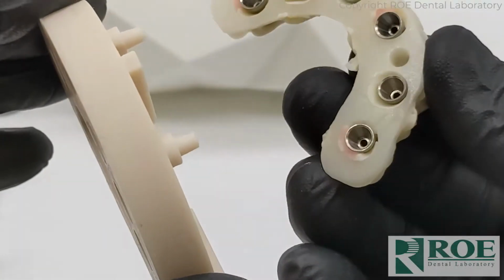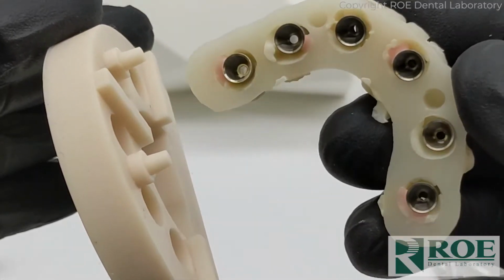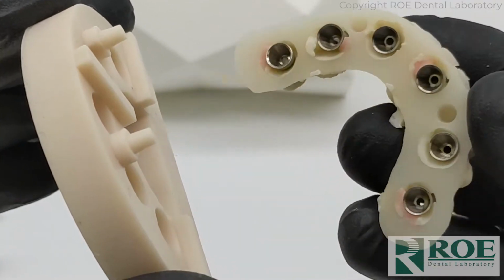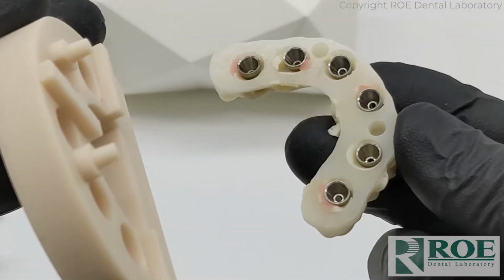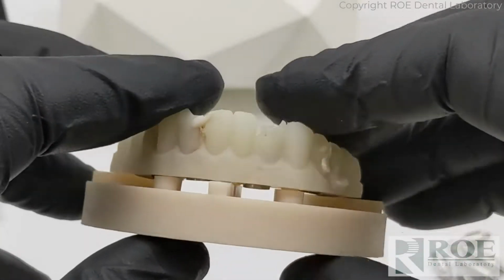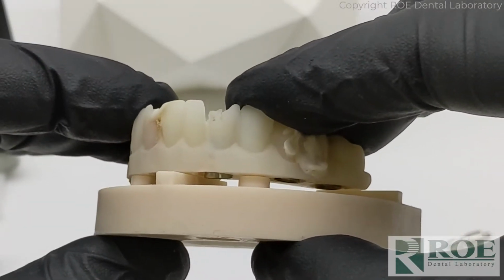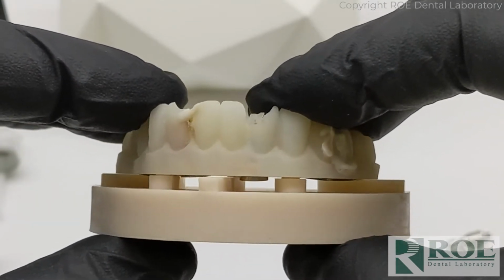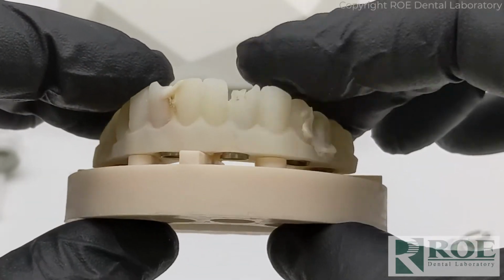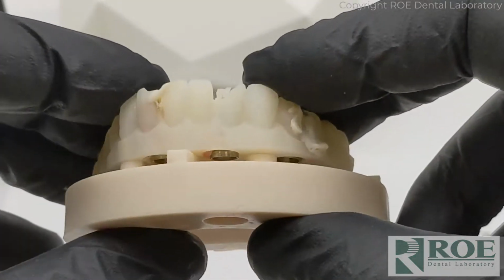But what guides this into the proper place are the 2 pins, 1, 2. These are the same pins that were in the mouth on the pin guide. So now when you take this out of the mouth, the RAPID appliance, and you plug it into the roto model, it's just like you took it back to the mouth, okay? And it's nice and stable. So you can see that there's no gaps between the supports and the appliance. So we know that the prosthetic is fitting to the model. That's step 1.